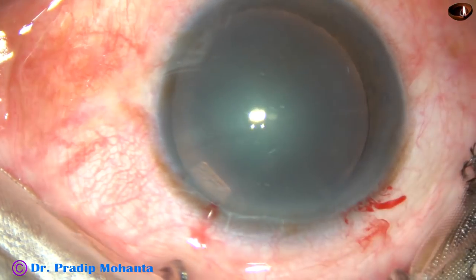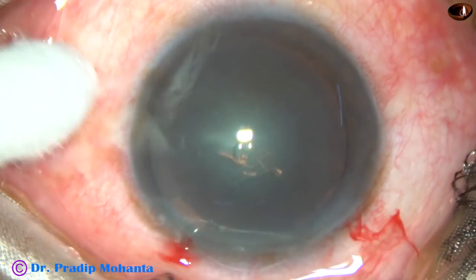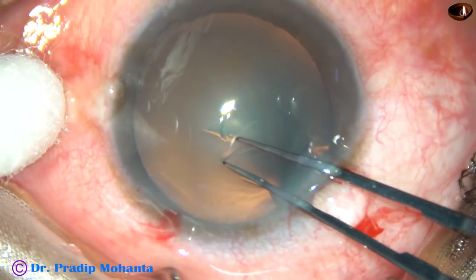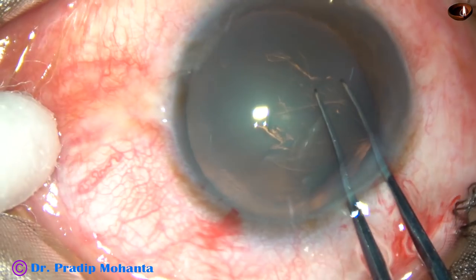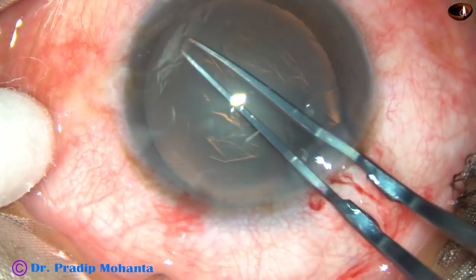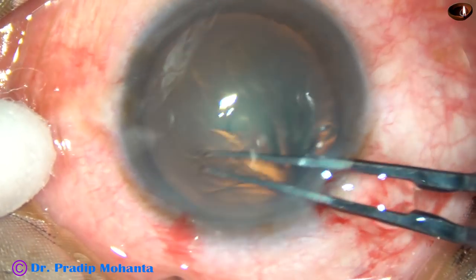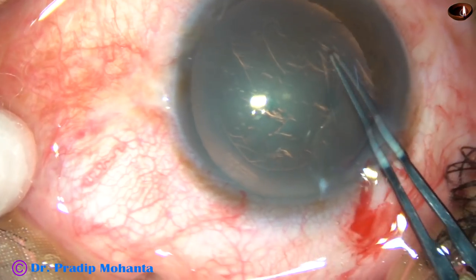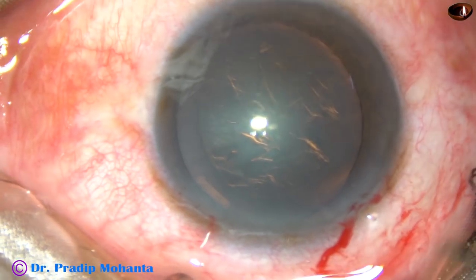Capsulorhexis is to be done. This is a 26-gauge disposable bent needle. A capsular tag has been raised, and now I hold this capsular tag with Utrata forceps, going anticlockwise, remaining at a certain distance away from the margin of the dilated pupil. And thus, I am making an optimum-sized rhexis for the lens tilt technique, where the rhexis should be about 5.75 mm.